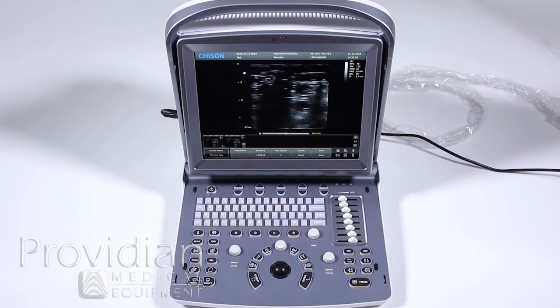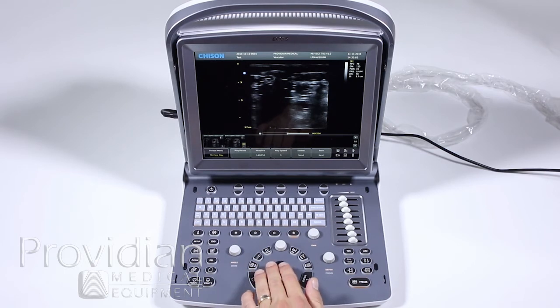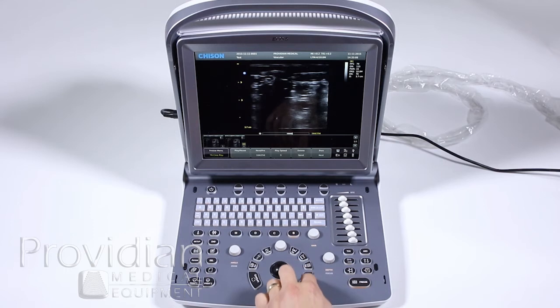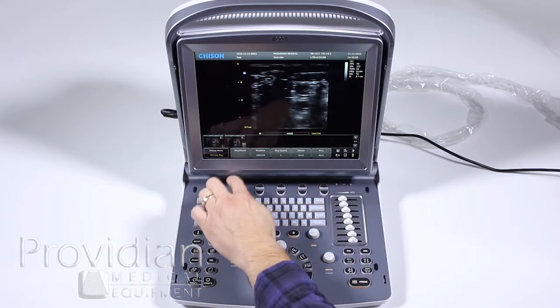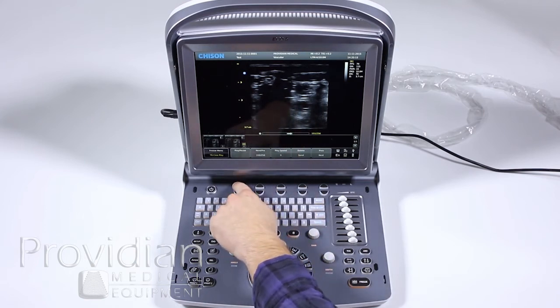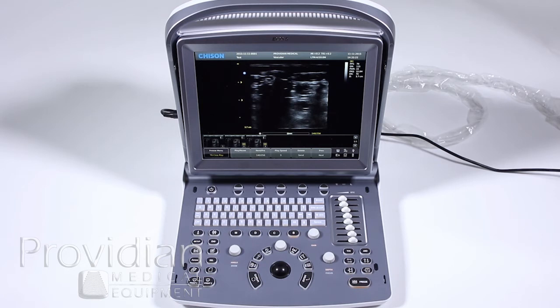There's a way to save just a portion of the clip. Use the trackball and hit enter to select a start point — the rest goes black — then move to your end point to highlight just that section. Hit play/pause to preview just that section, and when you're satisfied, save it. Notice how much faster it saves. This is also faster on exporting and saves hard drive space in the long run.